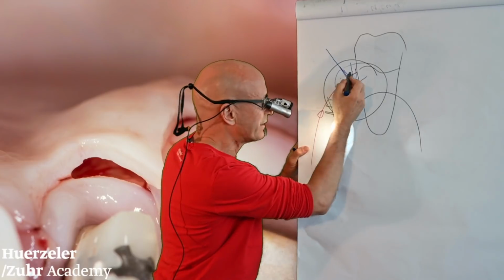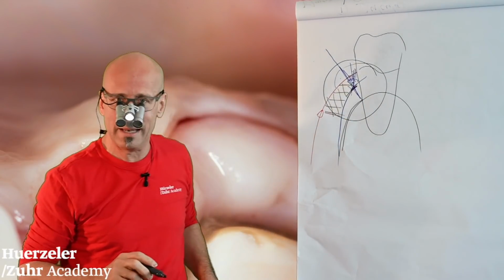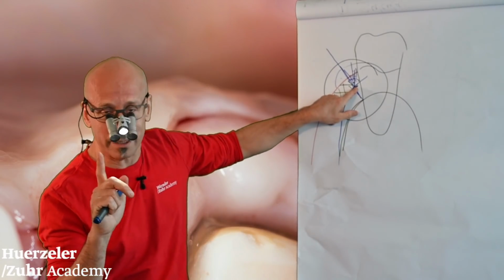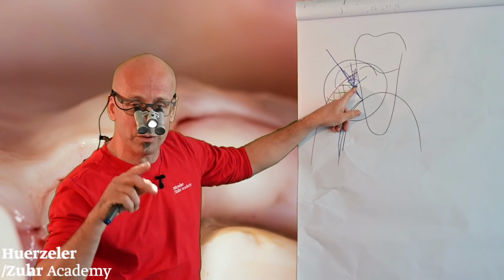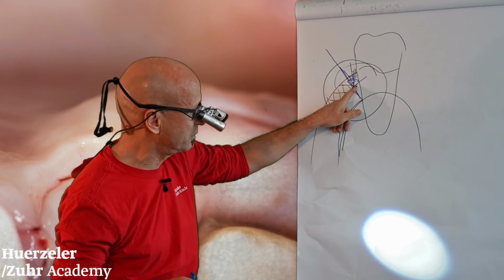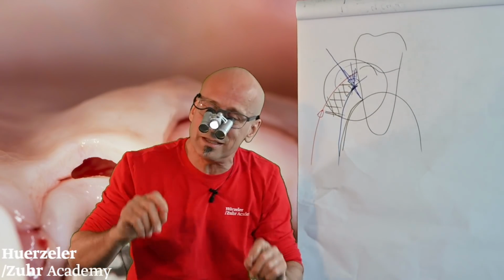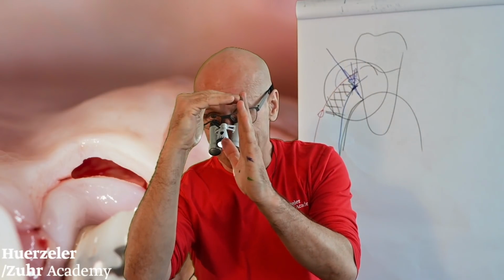So you can take this a little bit help and cut out a little bit of this tissue here first, that you find the right spot or the right site of the flap where you go into the mucosa, where you go into the connective tissue. This is the point. You have not up here, not here, you have to go here. And so by removing coronally a little bit of the tissue, you make it a little bit easier for you to create our flap, you remember.